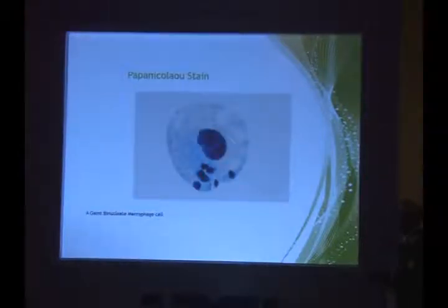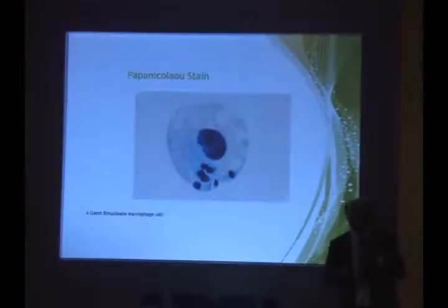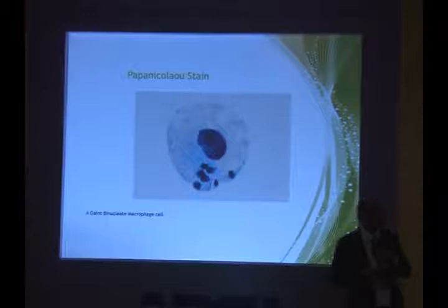This is a macrophage cell. Now I want somebody to answer me, suppose I report 2+ macrophage cells. What difference does it make to anybody? Why should I report it?